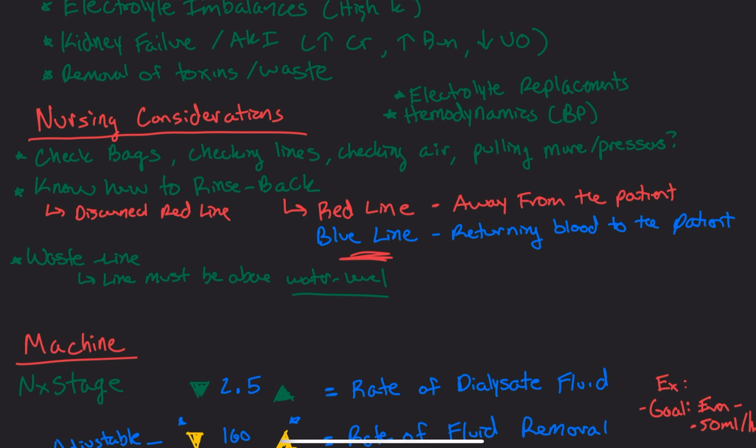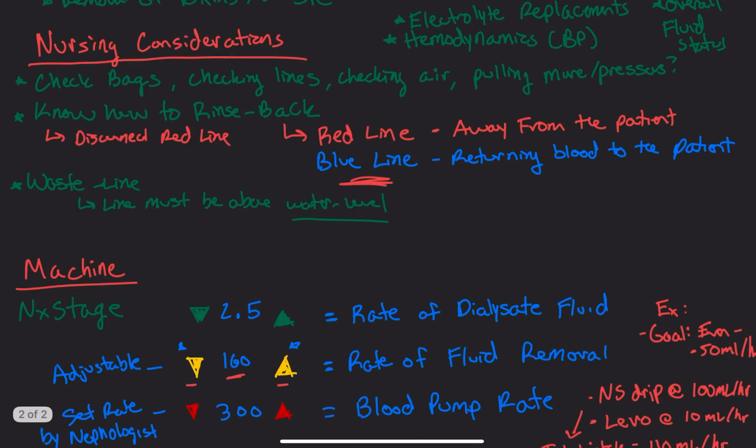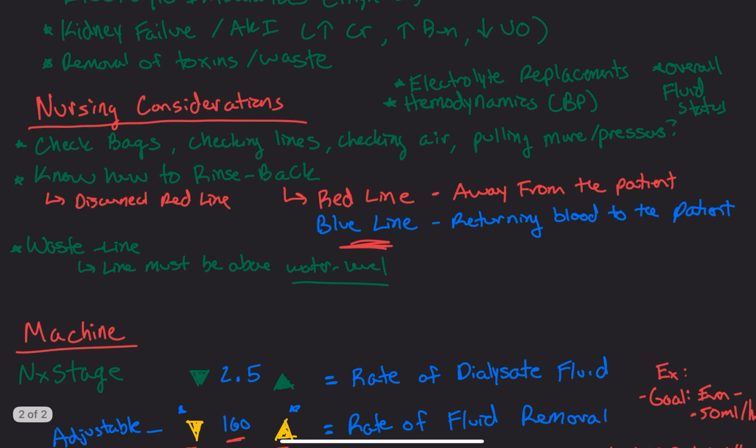And then another thing is just, obviously, your overall fluid status of the patient. So this can, like we talked about here, and the big one is fluid removal for patients that are fluid overloaded. So you're trying to see how much fluid needs to be pulled. And remember your goal, you'll have your orders, check your orders, knowing how much to pull, if it's too much or too little, just kind of the overall patient picture.